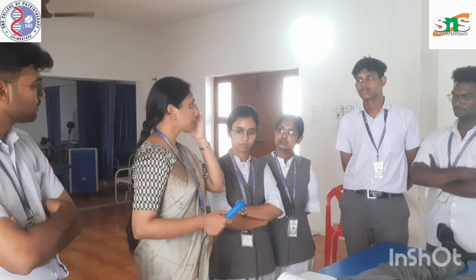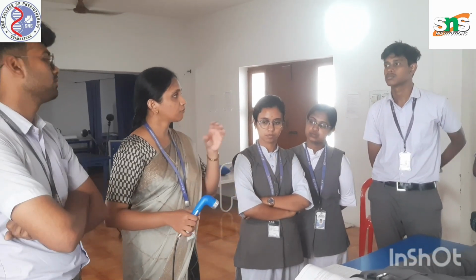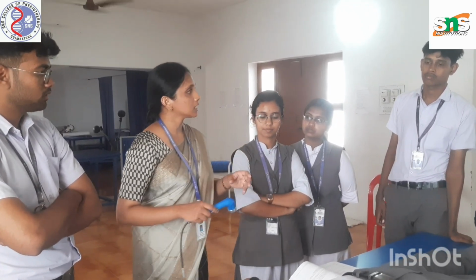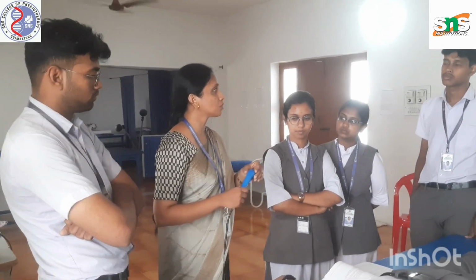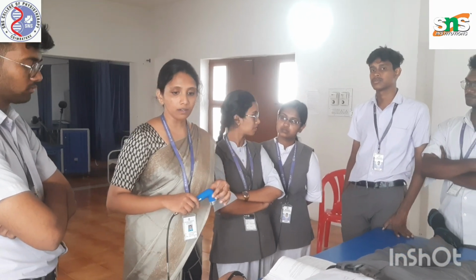Okay, so what variety of conditions can we treat with the help of ultrasound? Mainly inflammations. The inflammation of the epicondyles, the inflammation of the shoulders, ankle, all these things you can treat. Only inflammation, and also some adhesion types of conditions you can treat.